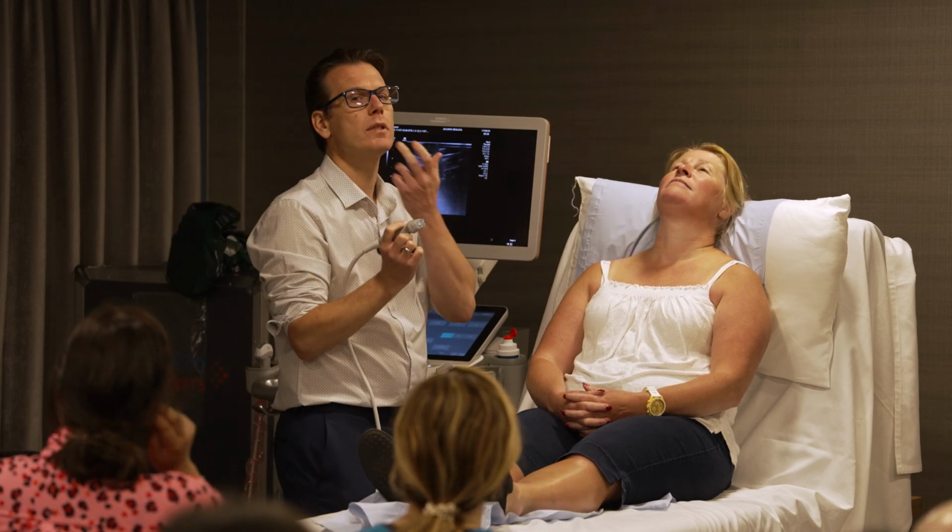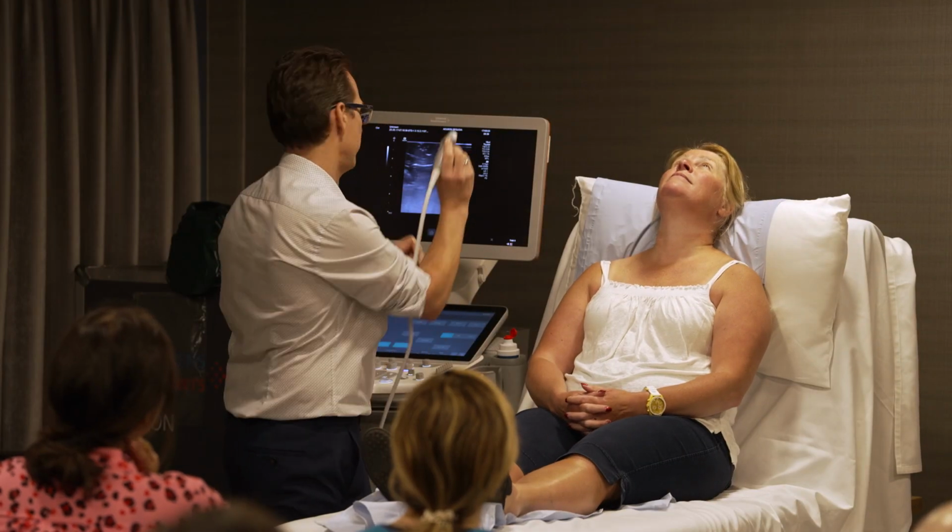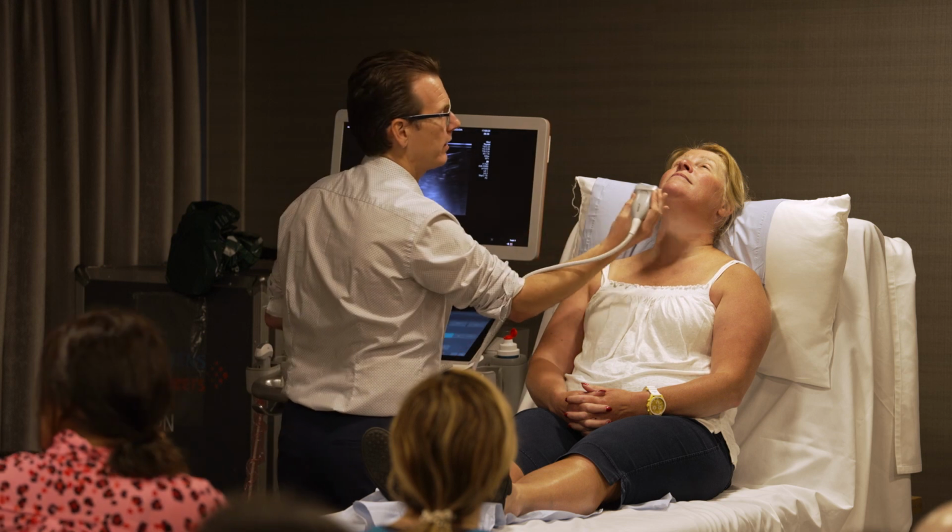So the first part is to start in the centre. I ask them to lift their chin up and just look straight up at the ceiling for this first part.